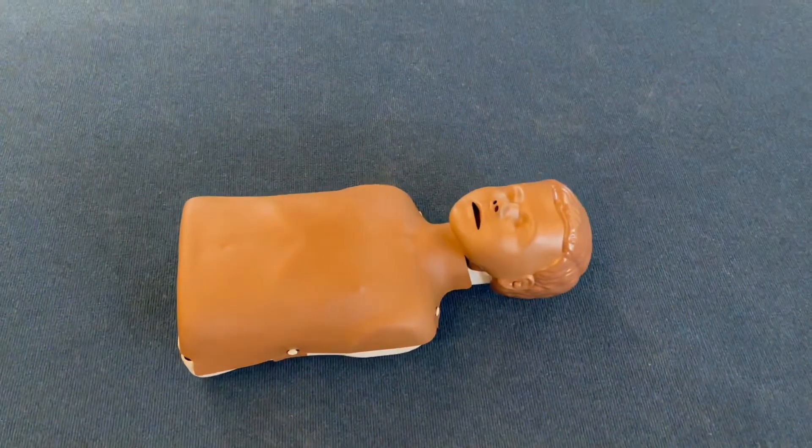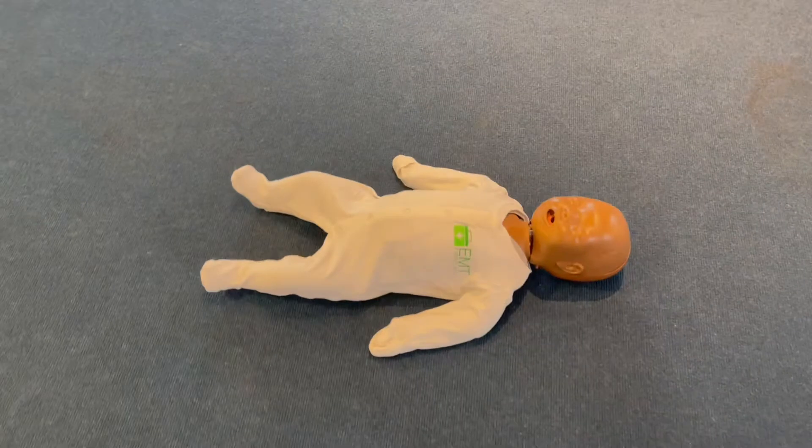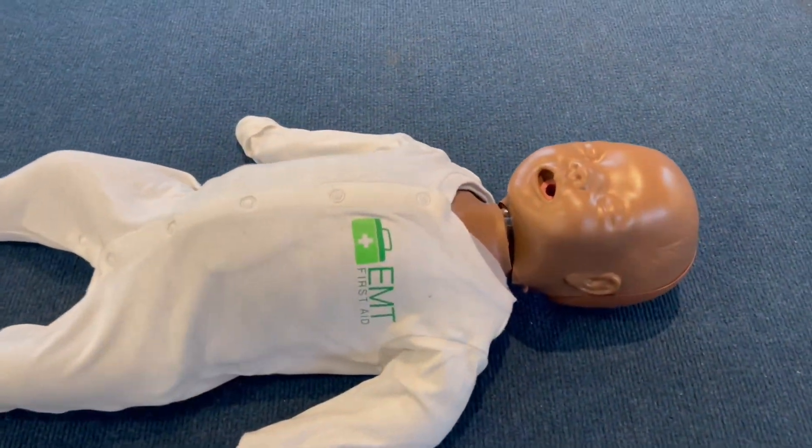In this video we're going to be looking at my new family — no, I haven't got married and I haven't had children, it's still just me and Lulu here. But I have got new additions to my family: my first aid family. I've got a baby and I've got a child — not just one, I've got several of them that we're going to bring to the classroom near you.